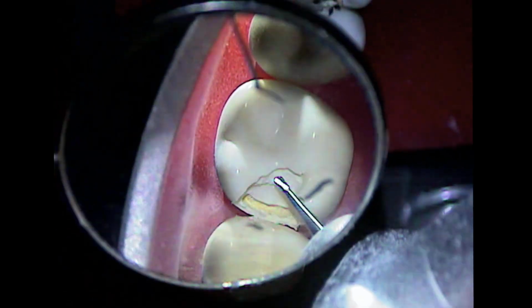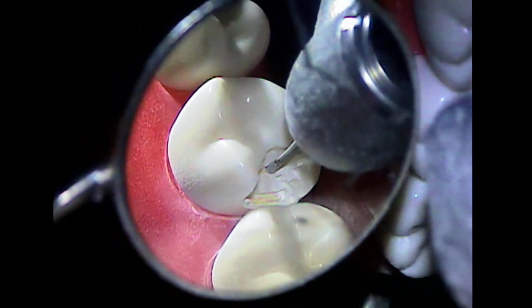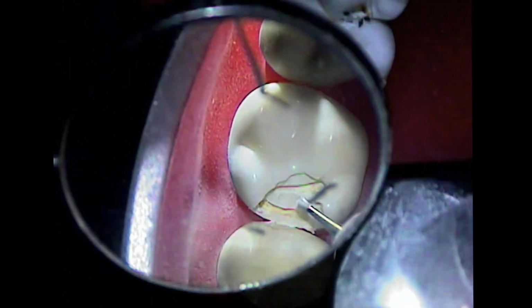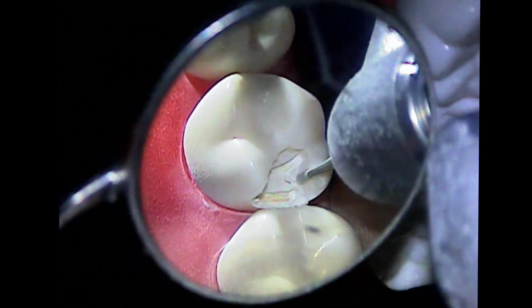And if you don't want to cut over the oblique ridge, look this way so you see where you are. Gotcha. Okay, look along the oblique ridge. Then you know you're cutting parallel to the oblique ridge. You're not going to cut up to the top of the oblique ridge and weaken the whole thing. Okay. All right, so continue going gingerly until you get gingival clearance. All right.